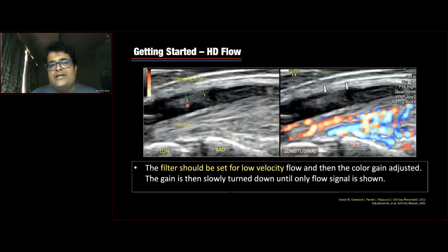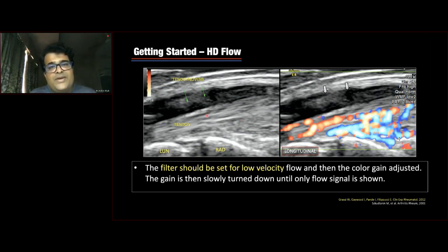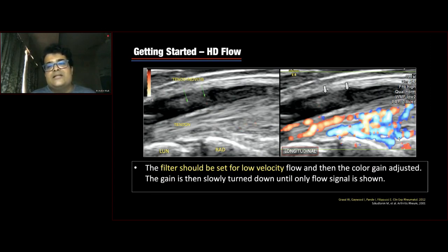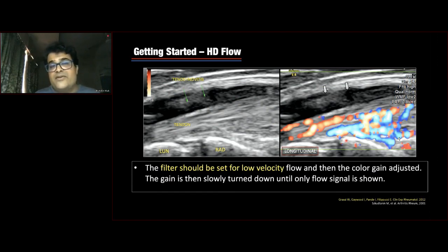One more GE technology I use day in and day out — HD flow — has almost replaced power Doppler for me. This new technology is extremely sensitive to low-level flows and also shows bidirectional flow of blood vessels. In a case of tenosynovitis shown here, after identifying the tendon, joint effusion, and effusion within the tendon sheath, switching on HD flow reveals intense vascularity — confirming active synovium. These newer technologies like HD flow are actually much better than conventional power Doppler for rheumatology.